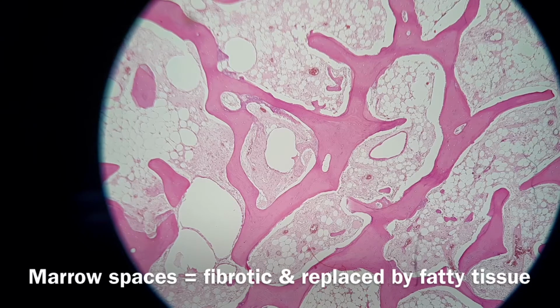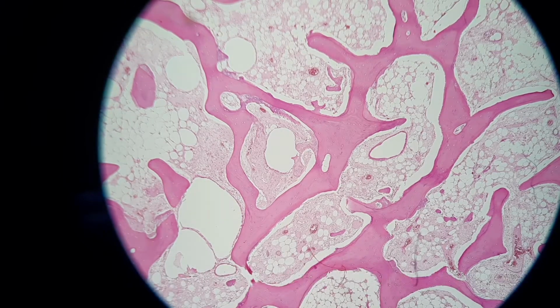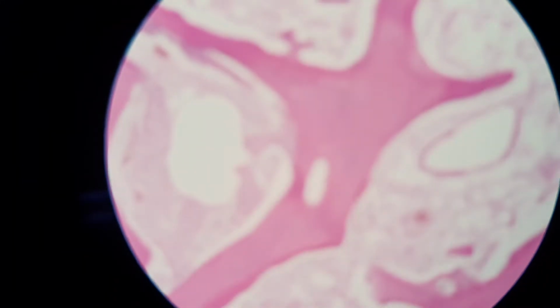So this is a usual finding in the elderly, in which all of the hematopoietic cells are replaced with fatty tissue and fibrotic tissue. So this is just an aging process. So we have a look at higher magnification.